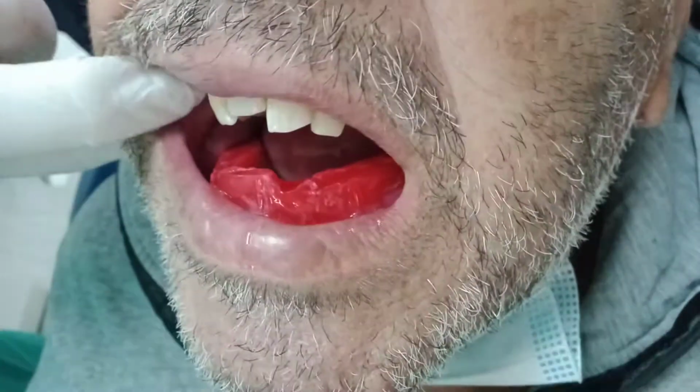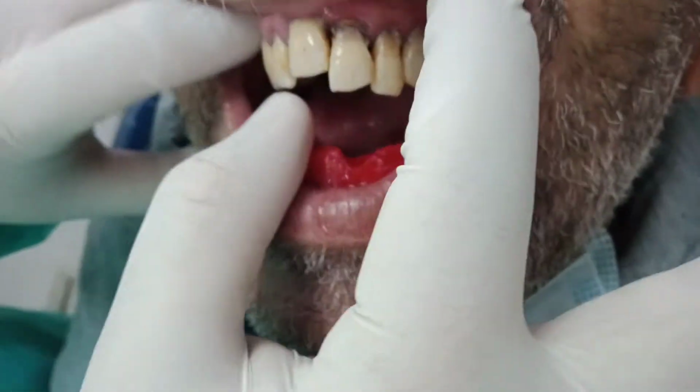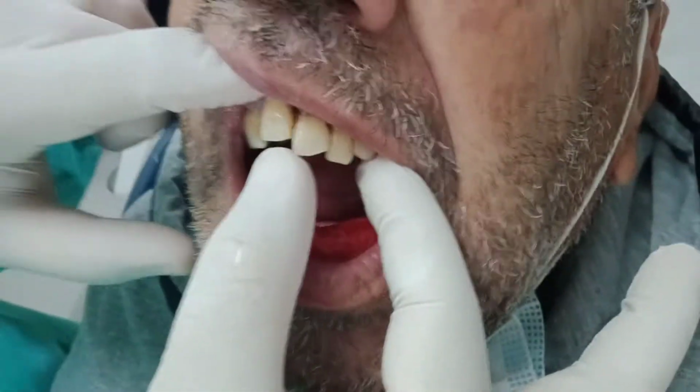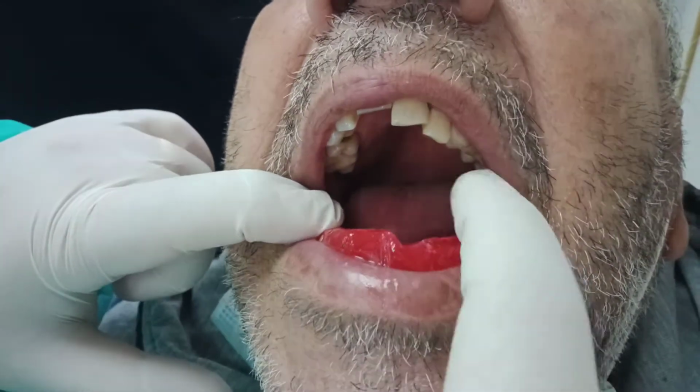Okay, this is the case that we were filming video for. We're going to do a temporary complete denture, opposing to an arch that is very irregular, and we have these over-erupted segments here. Okay, we have this over-erupted. And I asked the student to place some indentation in the wax.